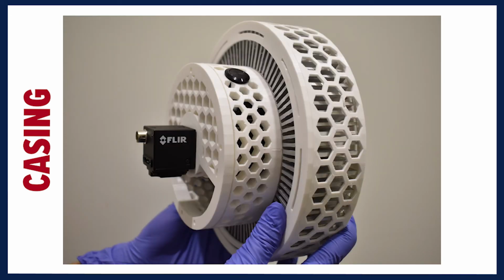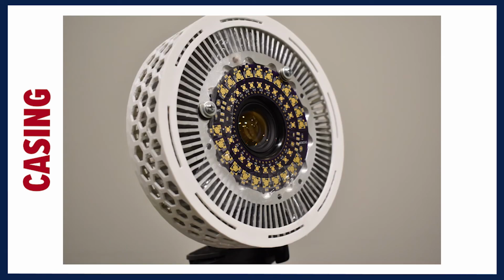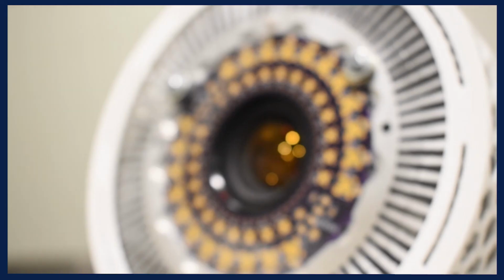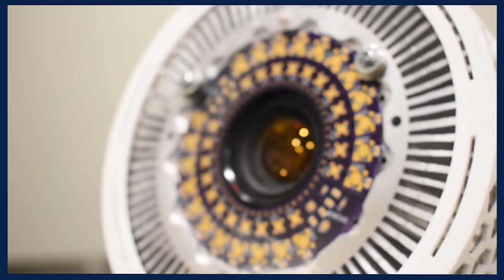Lastly, the casing subsystem was designed to effectively support the other components of the total system. The only requirement of it was to be able to carry the weight of the system without failing or suffering any structural weakness due to any heat generated by the system. Both of these requirements were successfully tested upon the completion of subassembly integration. Finally, with all subsystems integrated together, we have the ROIP.